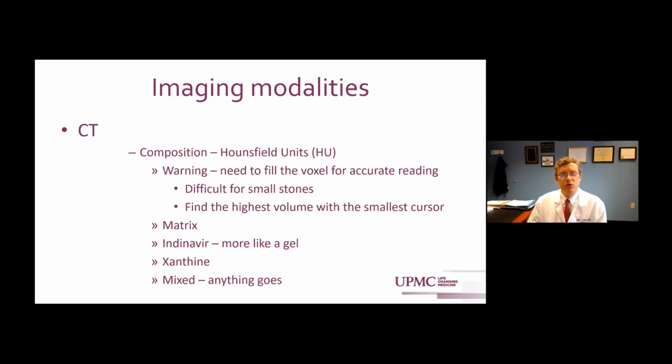Another couple things I wanted to mention before we talk a little bit more about the actual composition, things like matrix stones or indinavir stones. These are really non-calcified stones and may not even show up much more than just debris on a CT scan. Indinavir stones, also known as Crixivan, is one of the HIV protease inhibitors that we used more in the past, not so much anymore. But really, that's one of the classic questions of what stone is not visible on a CT scan. That's the answer, and that's really because it's more like a gel that sits down at the UVJ, and typically if you just flush it out and have them drink more and take a lower dose, not even stop the indinavir, you usually can stop that. Not so much of a problem today.